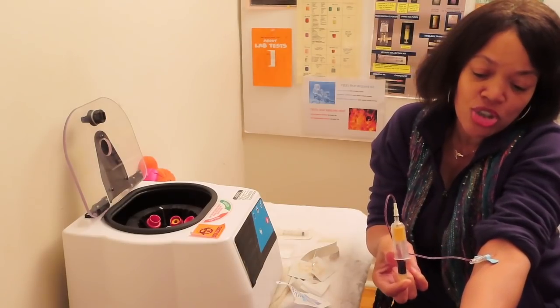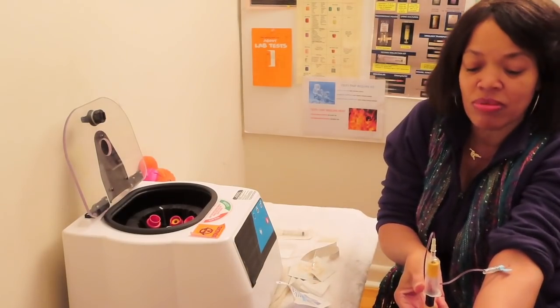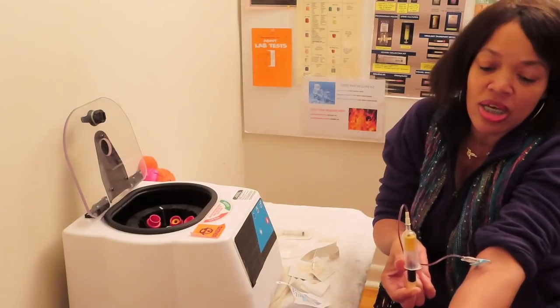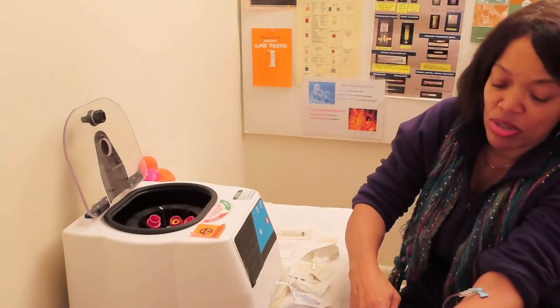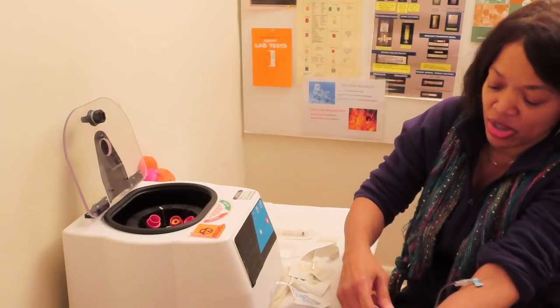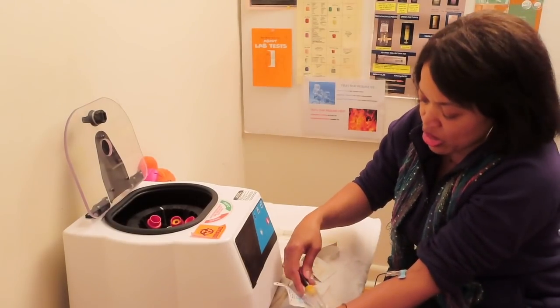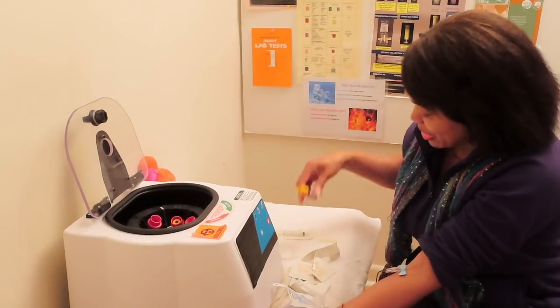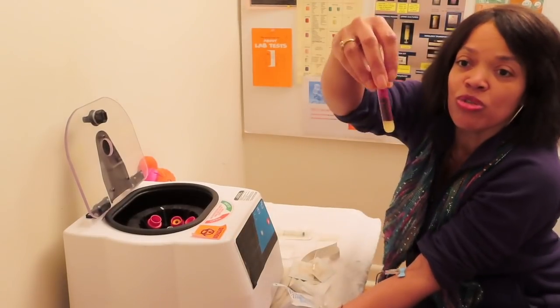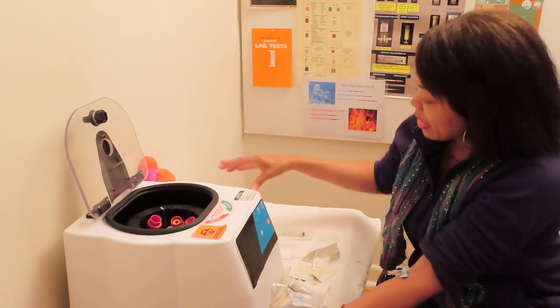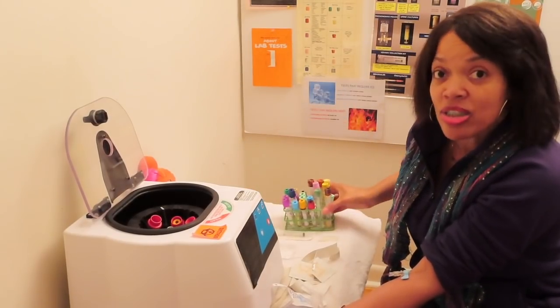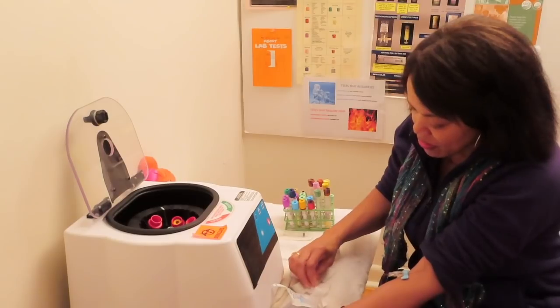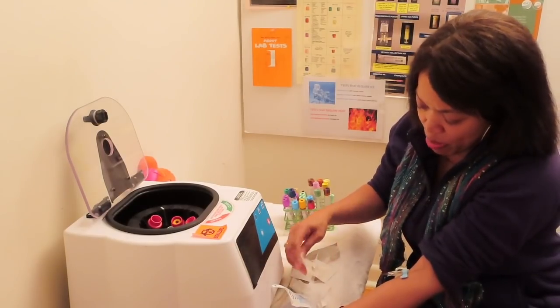So what you want to do because it's the evacuated tube system, you let the tube fill and let it stop on its own. Once it stops, you remove the tourniquet if you have a tourniquet on. Of course you do. So we're popping our tourniquet, which is my sleeve. We removed our tube. We have whole blood. We're going to sit it in our rack. If we have a rack, we always set it upright in our rack so that it can clot. And go ahead and finish your patient care.